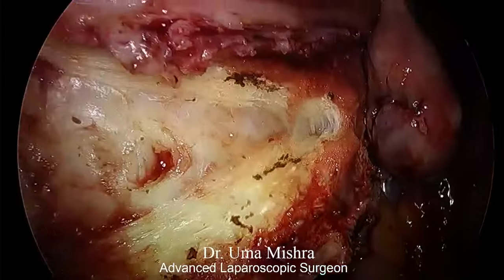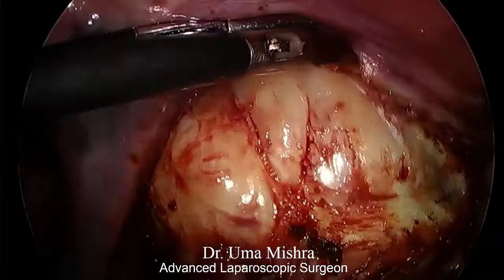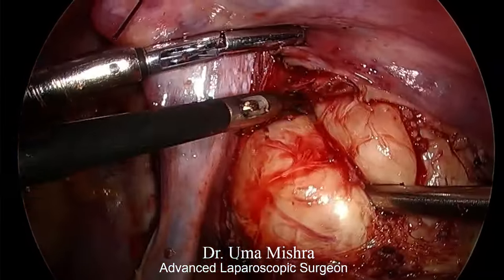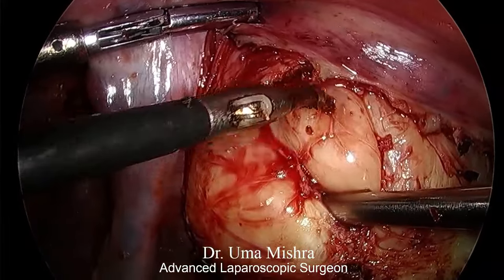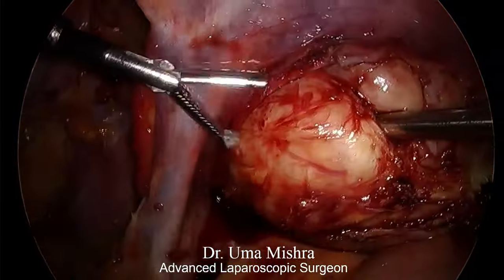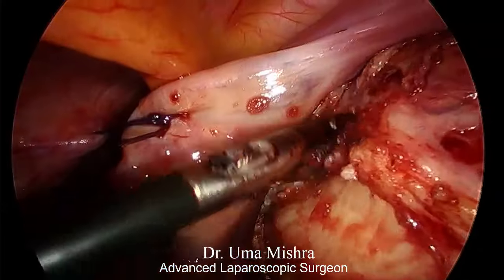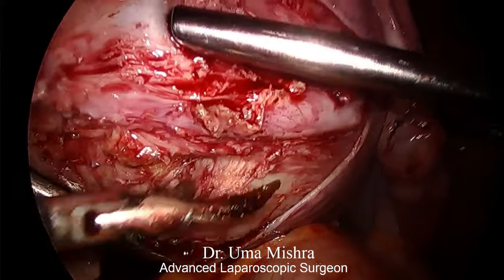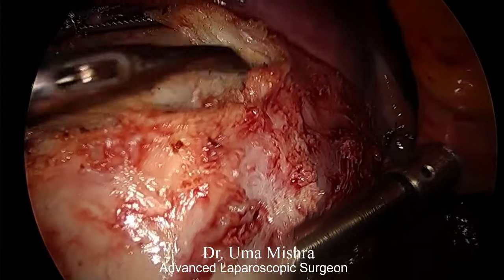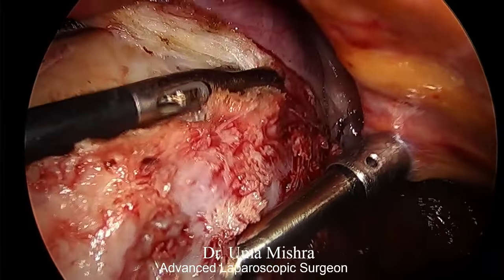As you can see, myoma is getting separated nicely. So once we work in the right plane, we don't have to struggle much. And don't try to provide undue excessive traction and counter traction. Just keep on excising a small area at a time by applying myoma screw close to the working area. So the main principle of surgery is to safeguard ureter and vital structures while we excise the myoma. The line of incision does not matter, but the good outcome and the safety is what matters.